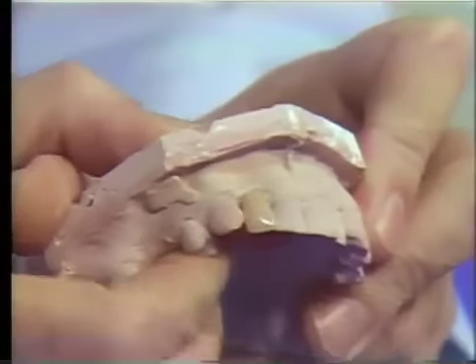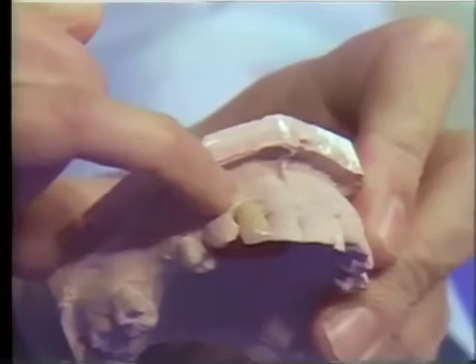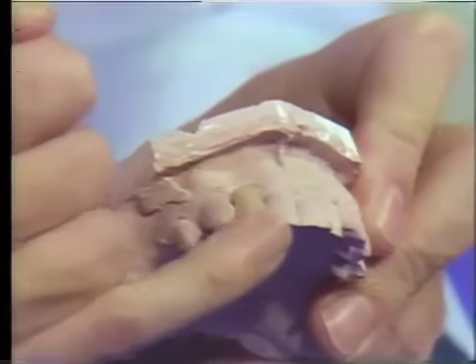Now, probably you select one in the first instance just a little bit too wide and a little bit too long, because you've got to grind and adapt it to the cast here. You want to adjust the incisal edge, and you want to develop the correct proximal contour. So this particular one we selected here is quite a reasonable selection for this particular case. So you get, again, a shade from one of those shade guides. You select the mold. The mold has a code number to it. This is N2, so you use N2 mold and the appropriate shade which you selected from the appropriate shade guide.